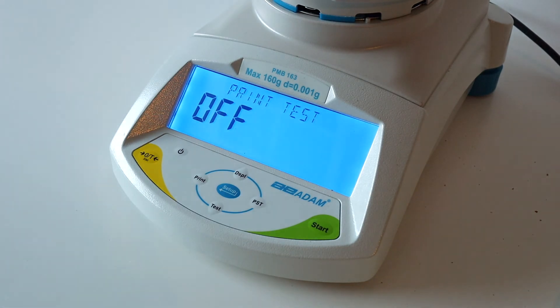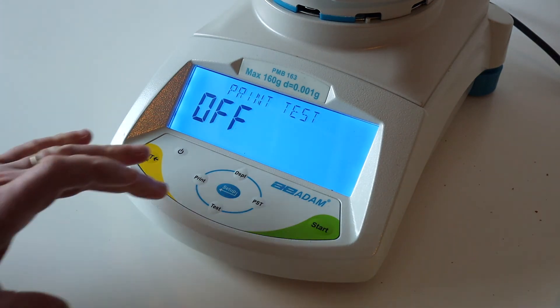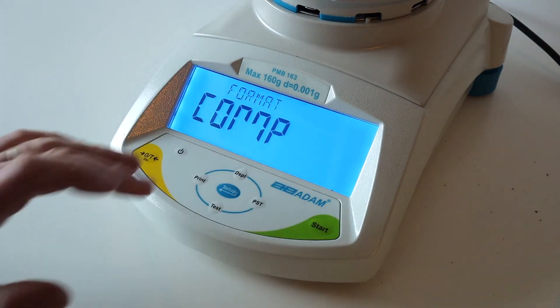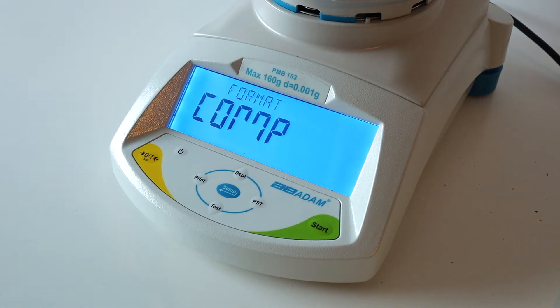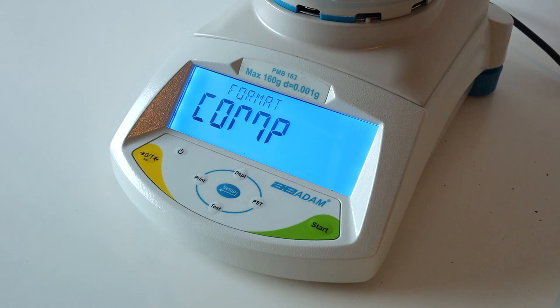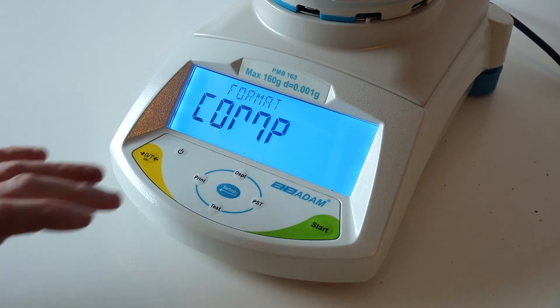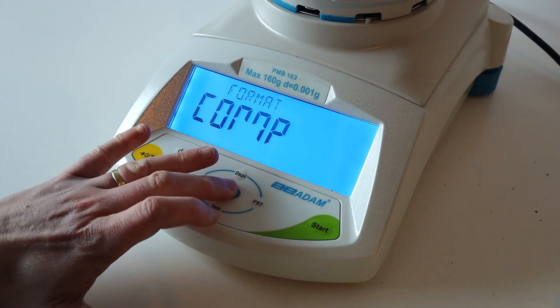If you have a printer connected, you can run a test print. If not, press Setup. Format is how you want to send the data from the PMB to your PC or printer. If you have neither connected, press Setup.